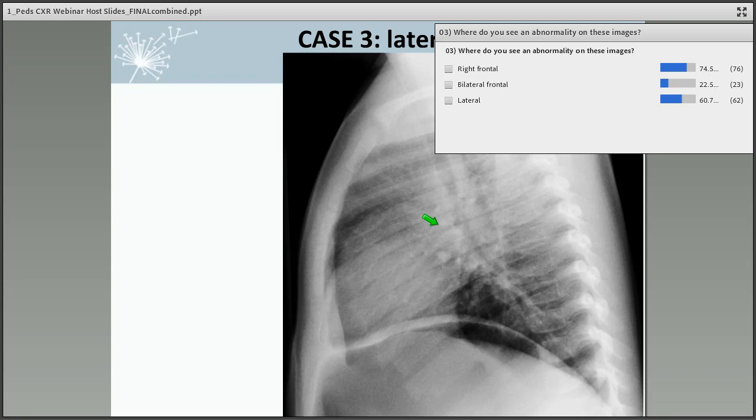Okay, so it looks like a lot of people are getting to be expert at the interpretation as they have a lot of correct answers. So I think you probably know by now with this story between the classic radiographic findings, the strong exposure history, the classic clinical picture, she definitely would get started on 4-drug TB therapy by directly observed therapy.